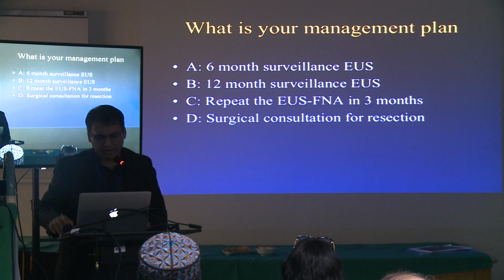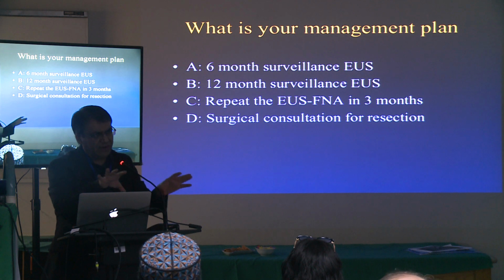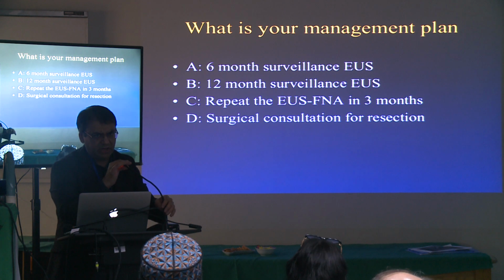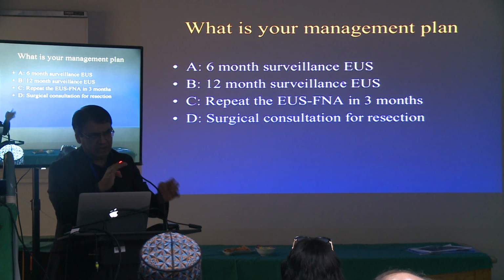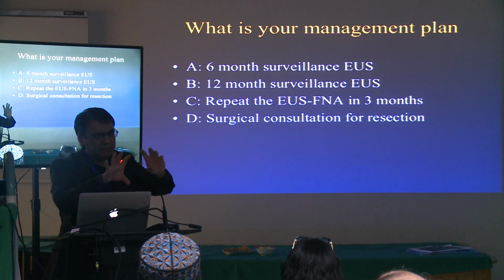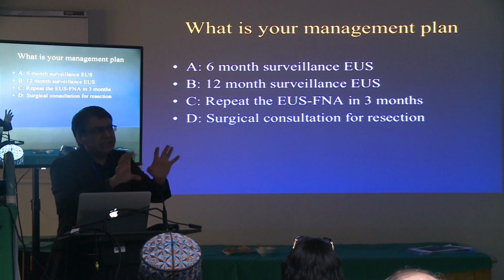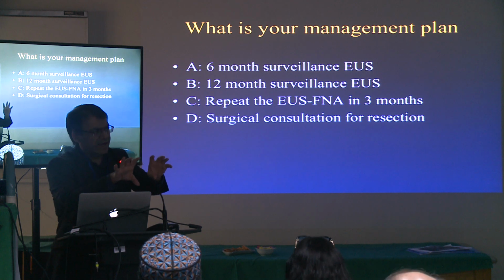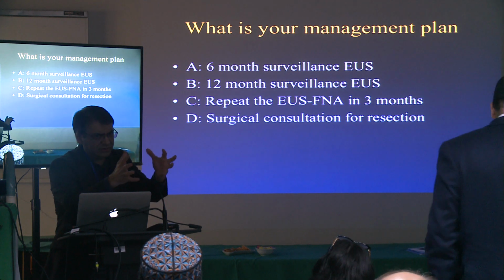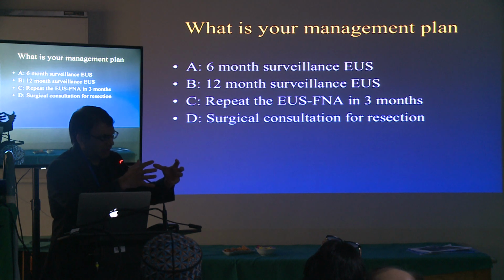But based on the history, based on these findings, what you see over there, just remember what I talked about in the history. It's some hypoechoic area. The duct is dilated post that hypoechoic area. So it seems like there may be some compression of the duct there.